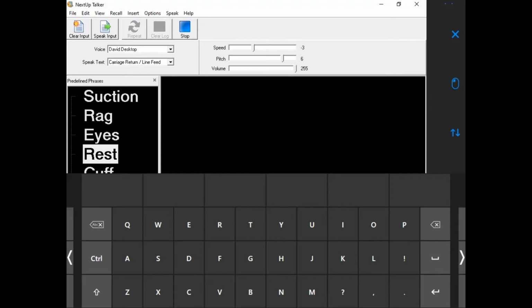Hello, I'm glad to see you. Can you please suction my blowhole? Can you please tilt me forward? Can you please tilt me back? Can you please swing my Tobii towards me? Can you please swing my Tobii away from me? Good night. Good morning.